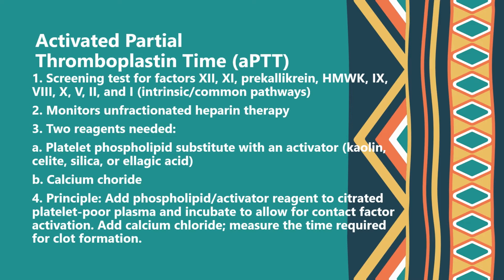For the principle, we add the phospholipid activator reagent to citrated platelet-poor plasma, which is our specimen, and then we incubate it to allow for contact factor activation. After that, we add calcium chloride and we measure the time required for clot formation.